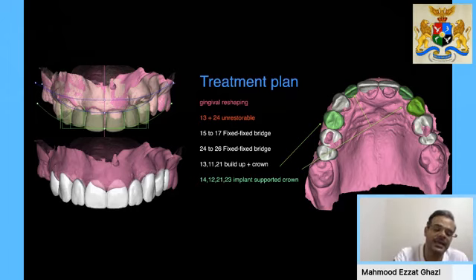But when I bring in the CBCT, I will be able to see the new bone levels and if I need to go for just a gingivectomy or I need to go for osseous crown lengthening at the centrals or not. You can see that the two laterals are now in a more favorable state as the gingival zeniths are at a lower level than the centrals.